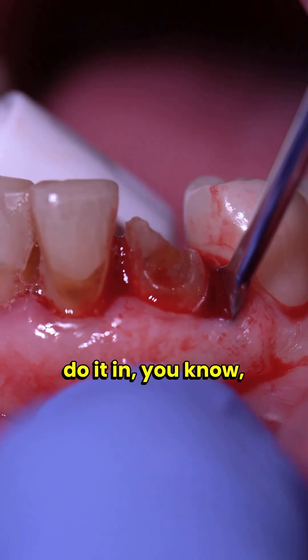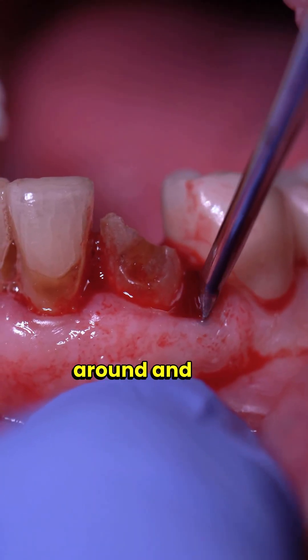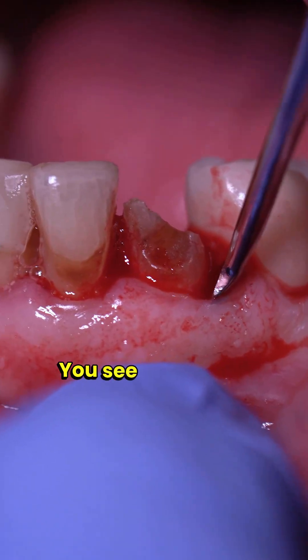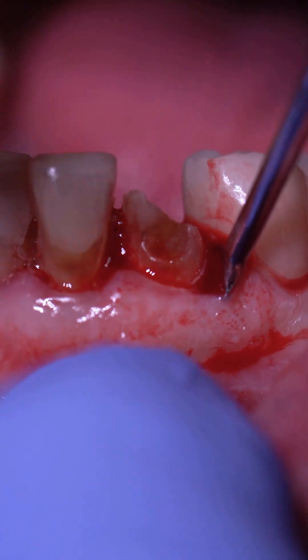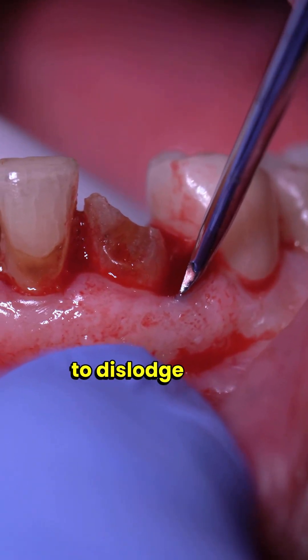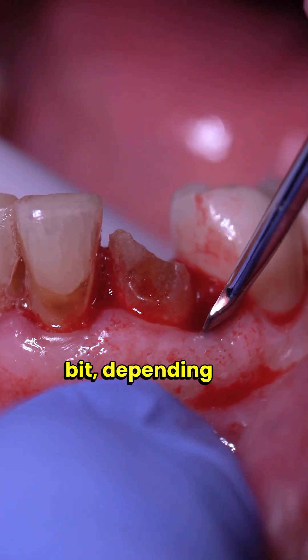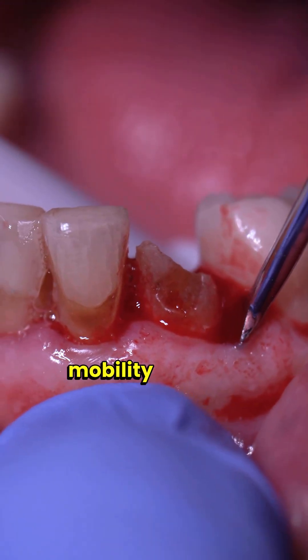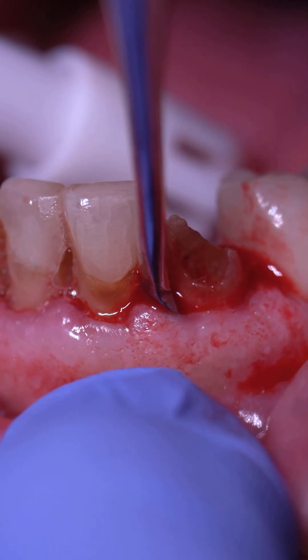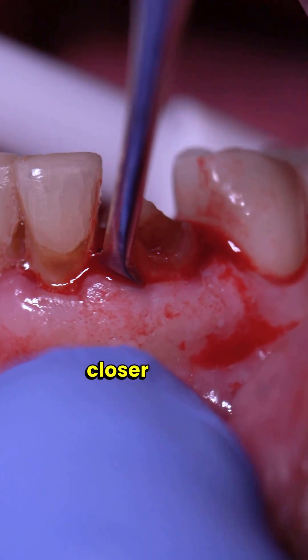You're not going to do it in one movement — this is an incremental thing where you go around and push bit by bit. You can see the tooth is already a bit displaced and it's going to be easier to dislodge now. I generally work at this depending on the tooth, the mobility of it, and how easy it is to get more mobility. I'll spend a good five to ten minutes on this, maybe closer to five.